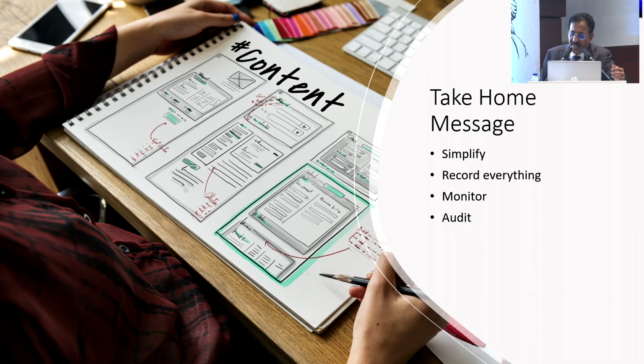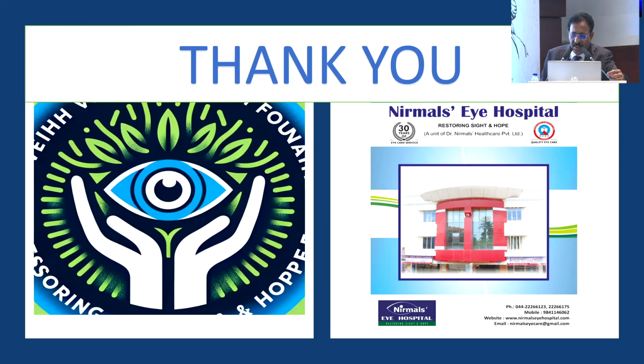Basically, since the staff are handling this, make it a very simple record or register, make it manual or EMR based. Record every aspect of sterilization and monitor them daily or at least weekly. See whether all data are filled up properly, and then audit them over a period of time, every month or every fortnight or every 3 months. So the auditing period also has to be defined.